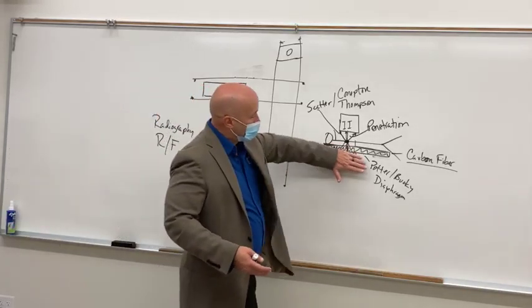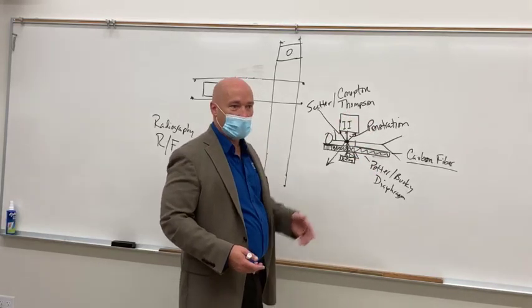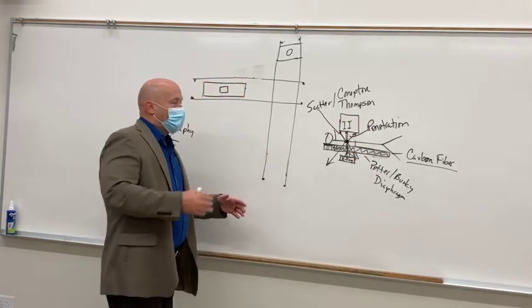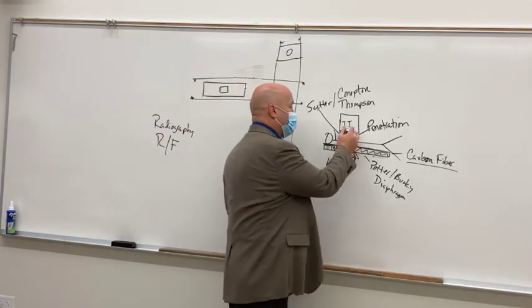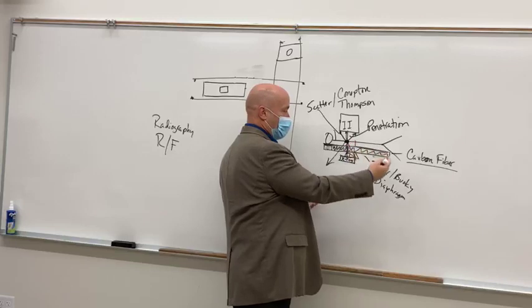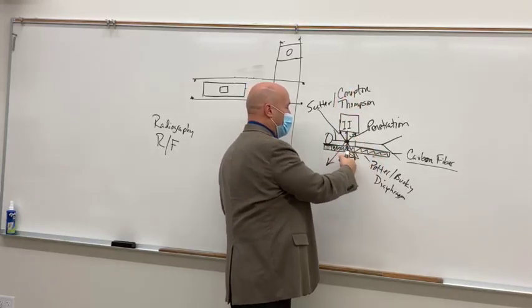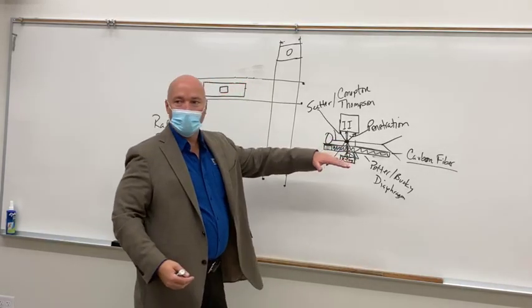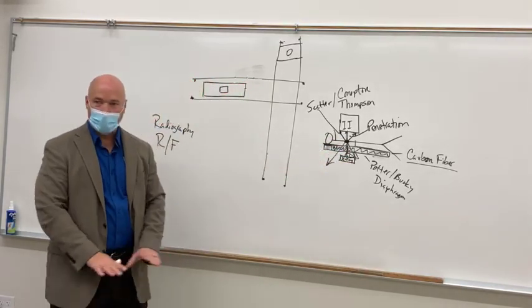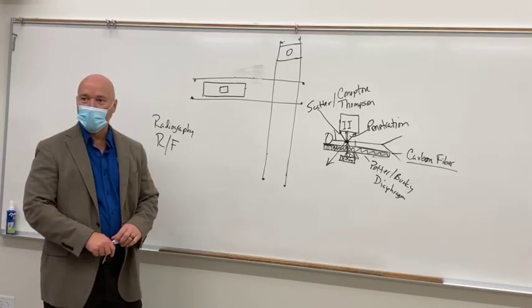So what they've got is this little flip up door, all right, and the flip up door covers that. Now the reason I point that out is because if we've got these interactions inside of the patient and the photons bounce off the patient and Compton scatter, and they go down through that hole right here, what part of your anatomy is right here?